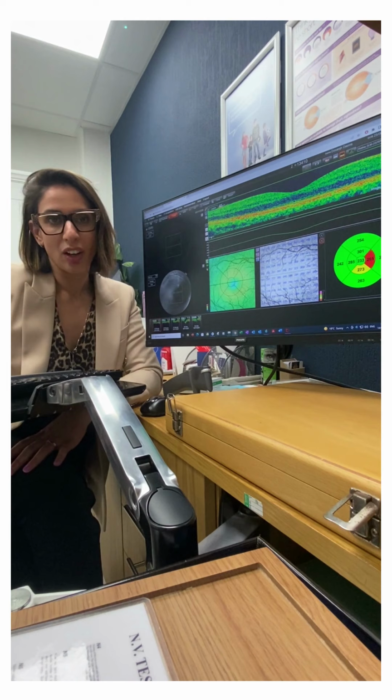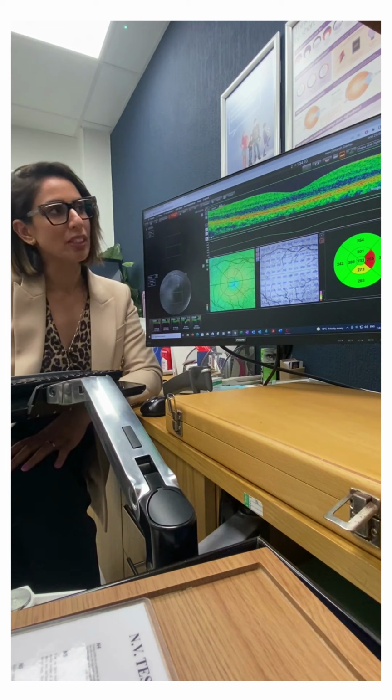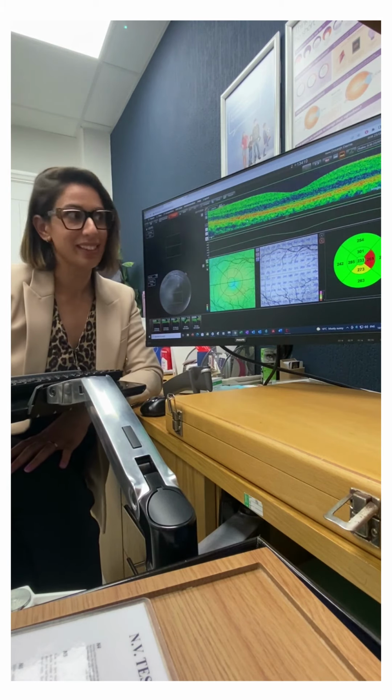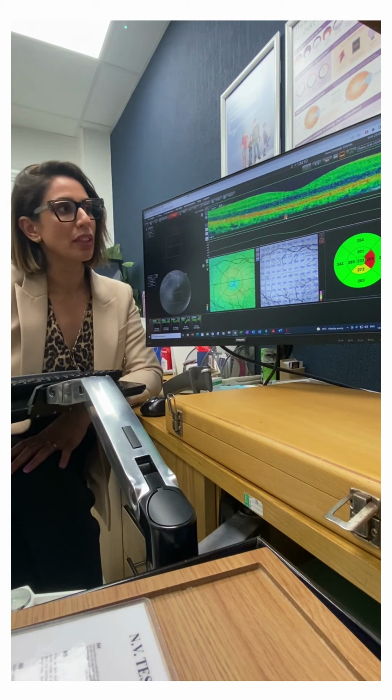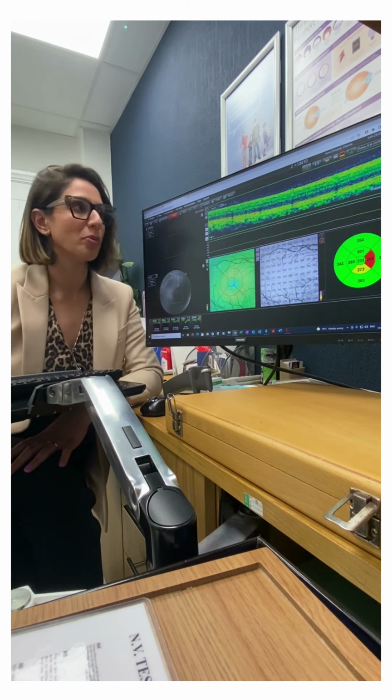The macula is the part of the eye that you use for your central vision. You may have heard of macular degeneration, and what we do is, as you look straight into the camera, take a scan, and it comes up with images a little bit like this. So wherever the green line is on the photograph, we are seeing its corresponding slice in 2 dimensions. And as I move this around, we are able to then see different cross sections at different places, and I'm looking at the architecture and the structure of how those layers are arranged to see how healthy the retina is. We can also elaborate on this and take measurements.